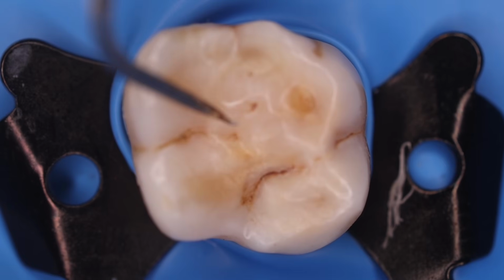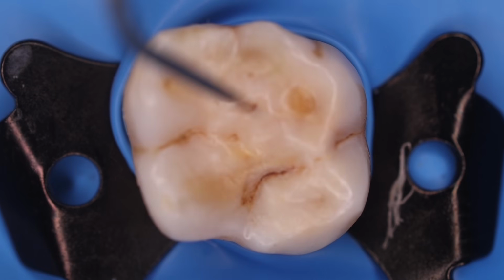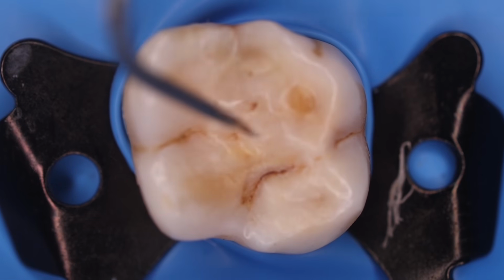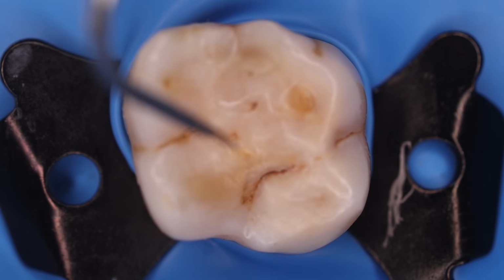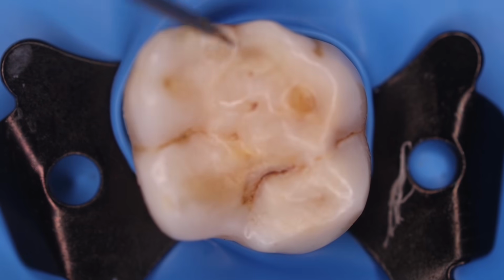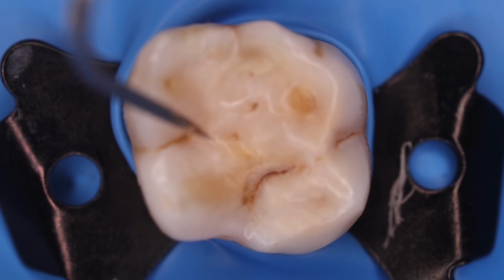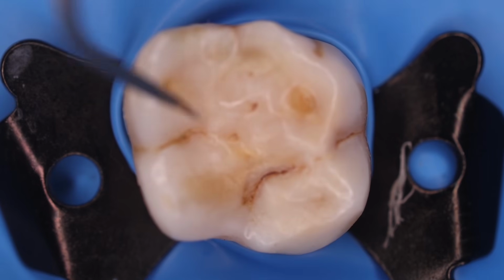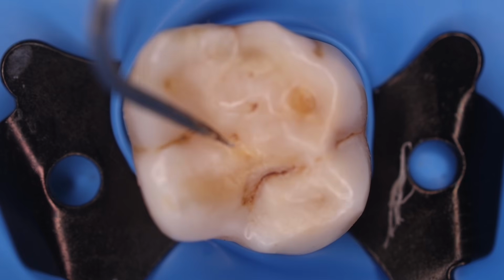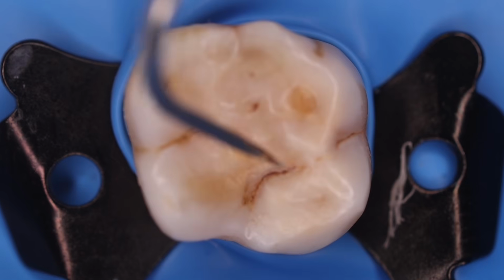Over here we are not using any microscope, and we have not taken any CBCT for this particular tooth, and that's why we need to prepare a straight line access. However, if we need an orifice directed access, then we need a dental microscope, and we should also consider a CBCT. In this case we have neither, so we will be doing a straight line access.